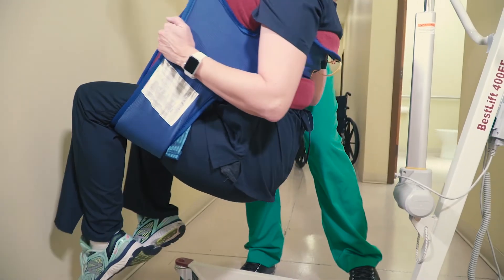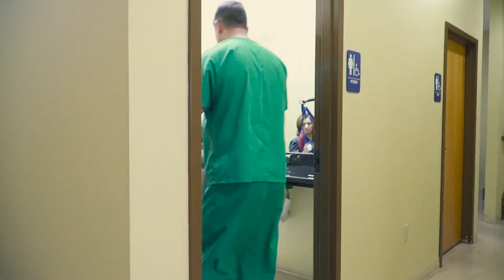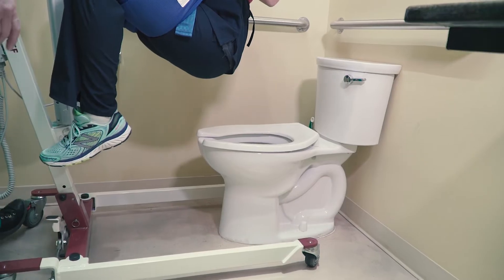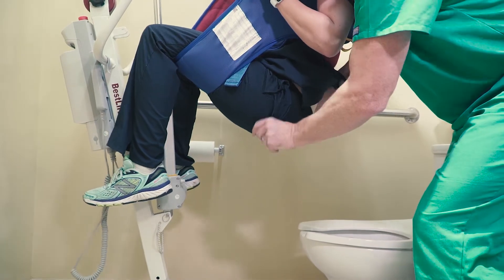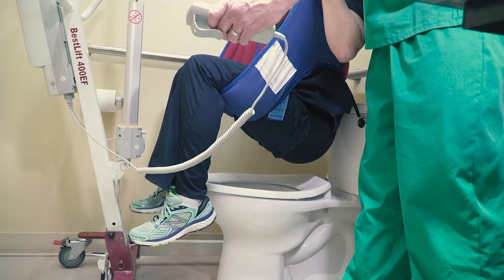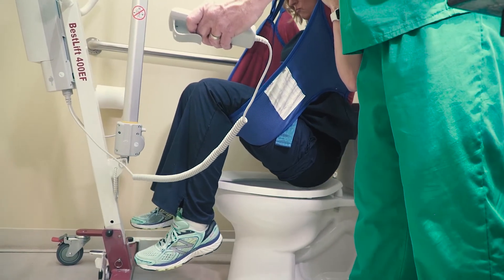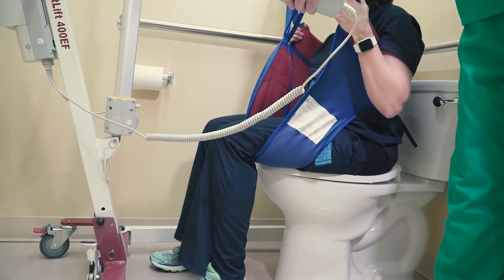With the patient lifted, you can now move them easily towards the toilet. Once you have positioned the patient over the toilet, lock the lift in place. With the patient's permission, pull the patient's pants down to just above the leg straps. With one hand on the patient and one hand on the lift controls, slowly begin lowering the patient until they are fully seated on the toilet.